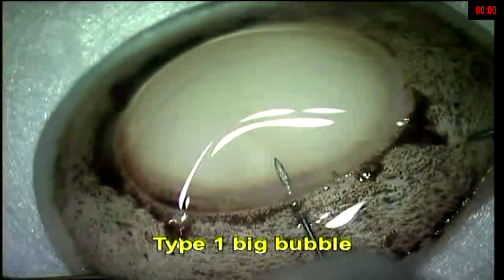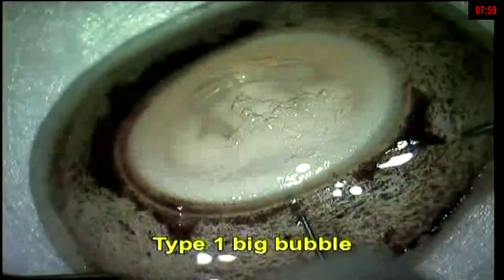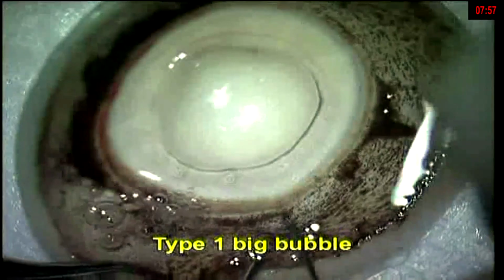You can see you're looking at the endothelium on the top, okay? I've turned it upside down. So what you are seeing on the top is the endothelium, remember that. From the sclera, take a 30 gauge needle, go inside, and you see I've created a bubble. Now look at this bubble, it does not go to the periphery. This is a type 1 bubble.